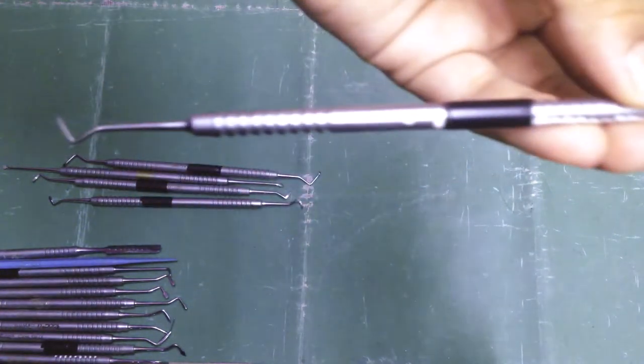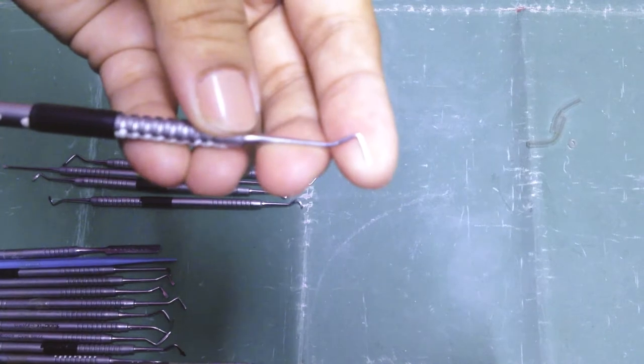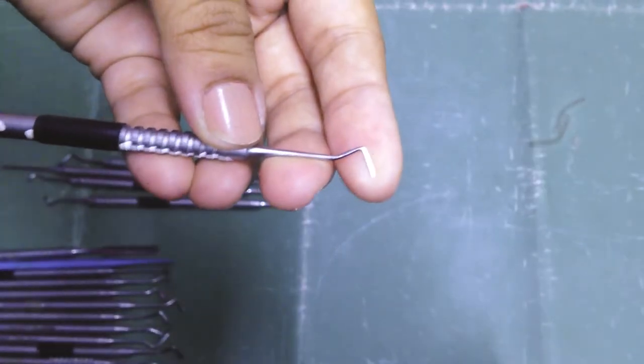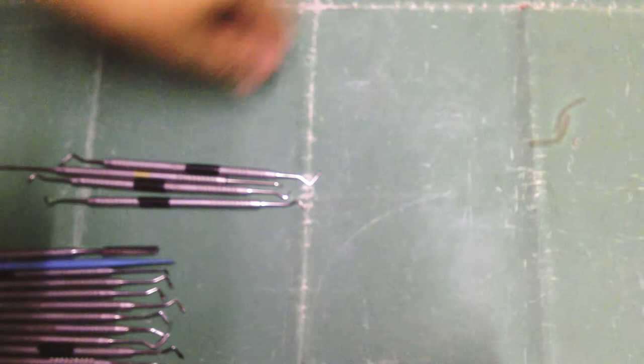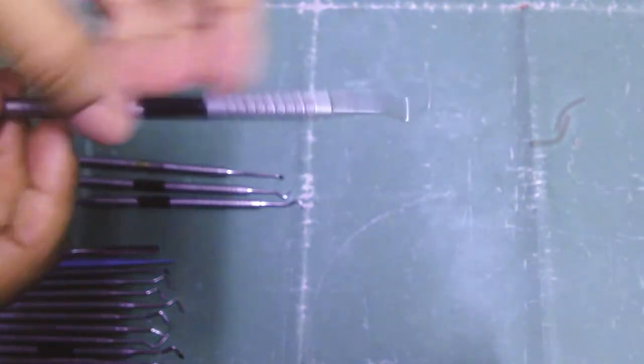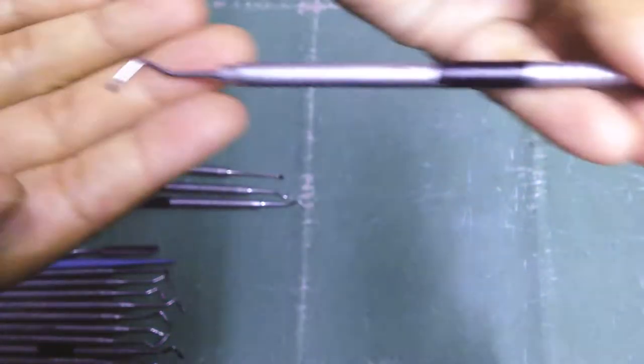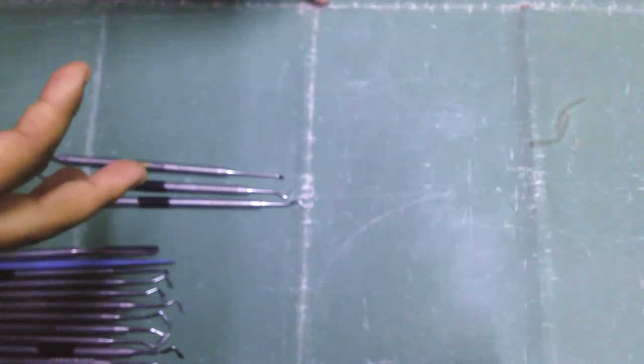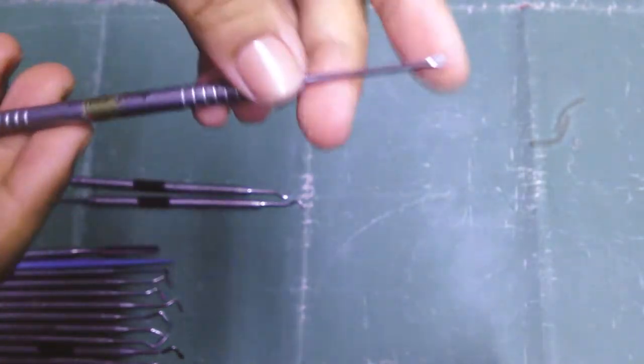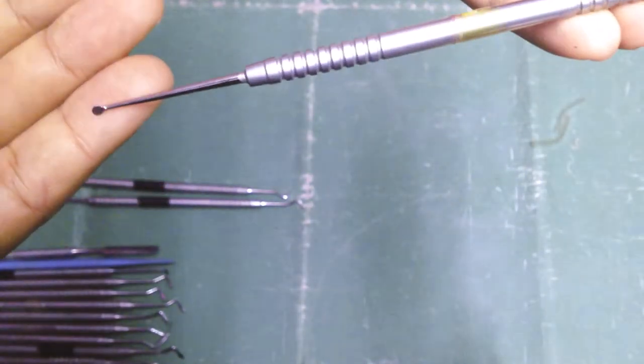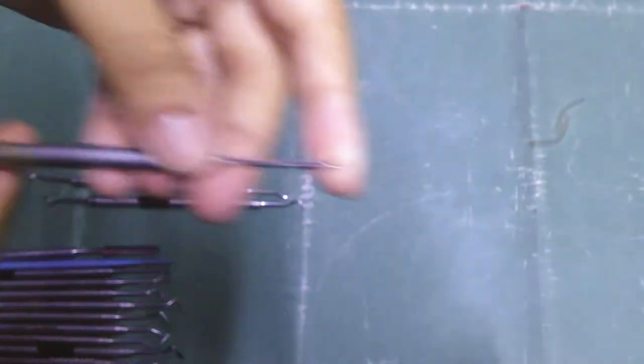As you can see, this is also a double-ended one. Then we have a spoon excavator. Then we have a discoid-cleoid instrument. This is a disc-shaped discoid and claw-shaped cleoid instrument.